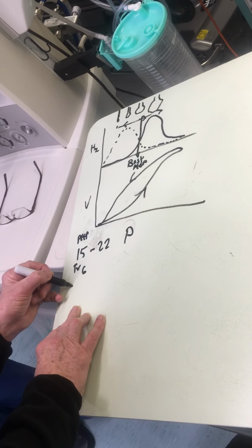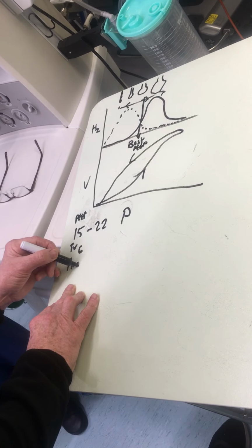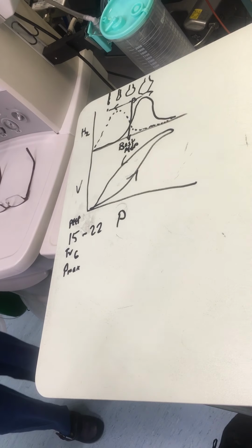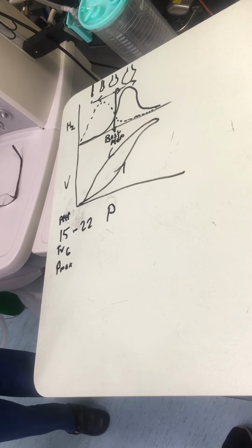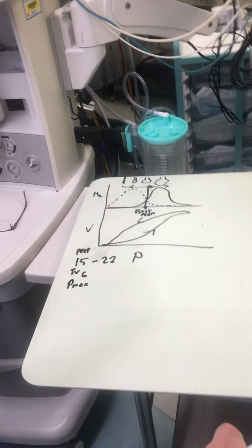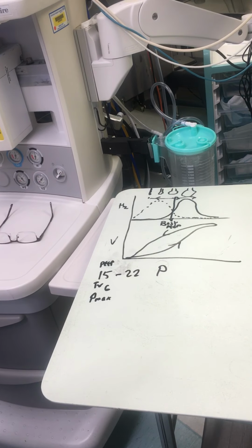So we've said a Pmax. Now, Pmax is a bit tricky. These ventilators are not good for the sort of respiratory mechanics measuring that the other ones are, so you're just going to have to go for Pmax. Pmax is actually P plateau. That's what you want to be thinking of, because it's the P plateau that the alveolus sees, and it's the alveolus that you're worried about damaging.